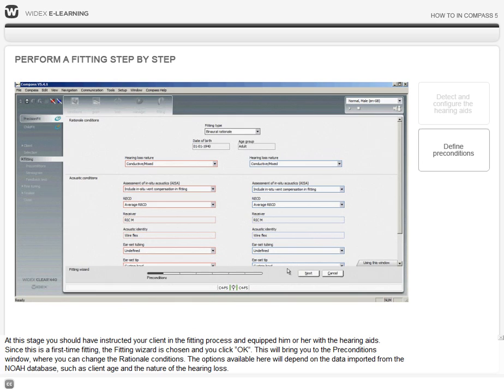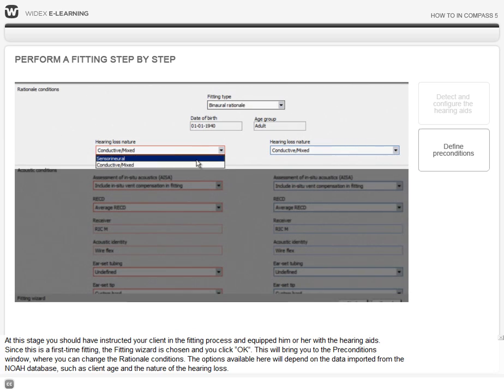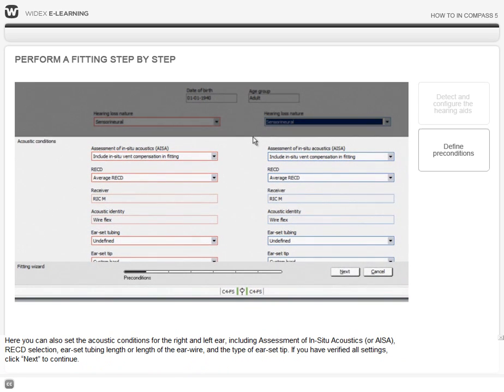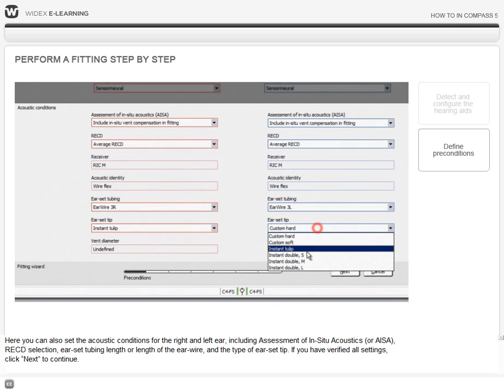This will bring you to the Preconditions window, where you can change the rationale conditions. The options available here will depend on the data imported from the NOAH database, such as client age and the nature of the hearing loss. Here you can also set the acoustic conditions for the right and left ear, including assessment of in-situ acoustics or AISA, RECD selection, ear set tubing length or length of the ear wire, and the type of ear set tip. If you have verified all settings, click Next to continue.